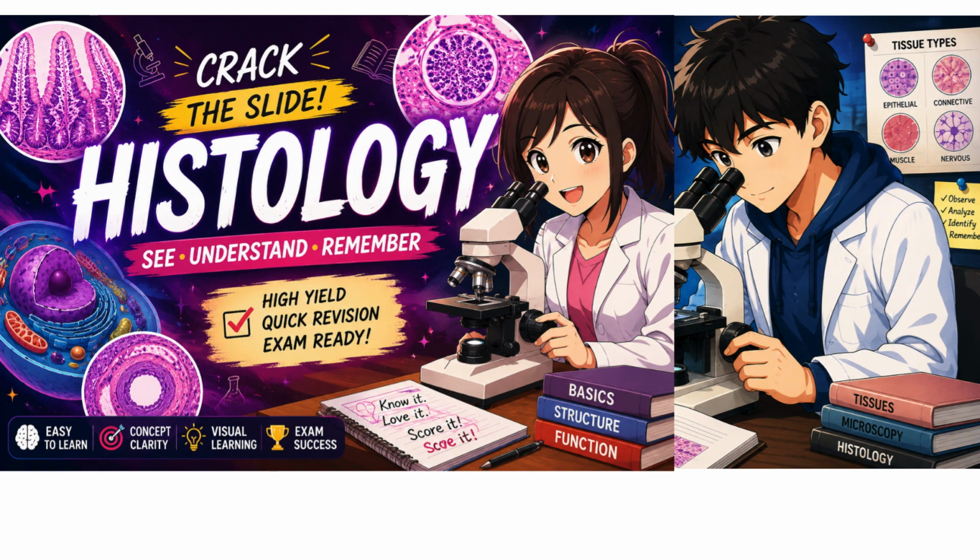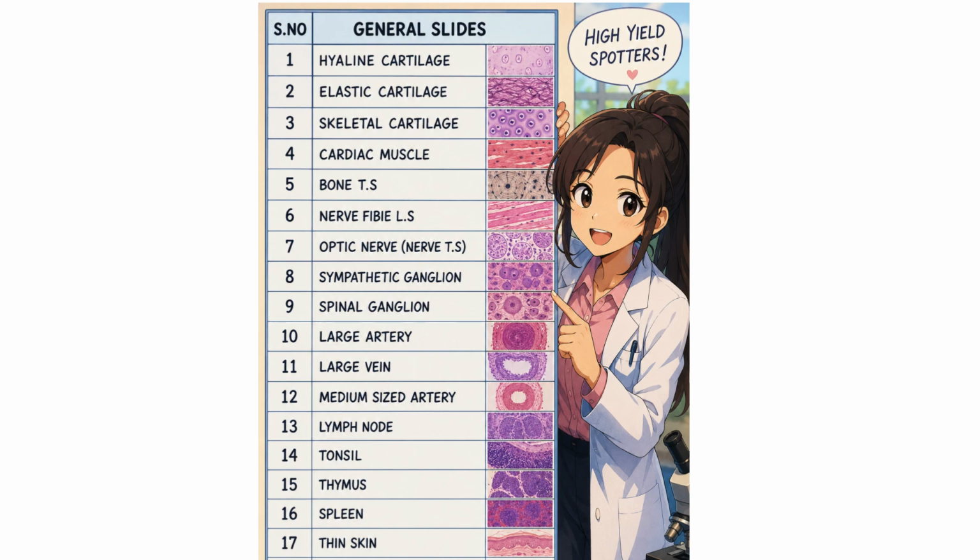For histology spotters, you have to know 3 to 4 key points to each slide. Now coming to general tissues, for hyaline cartilage, the points are it is bluish white ground glass matrix. Chondrocytes are present in lacuna, often in groups, that is isogenous groups, and perichondrium is at the periphery. It is found in tracheal ring, articular cartilage, and costal cartilage.